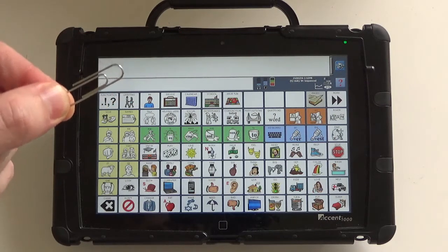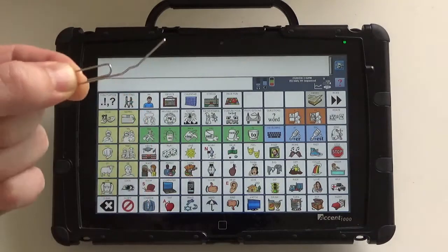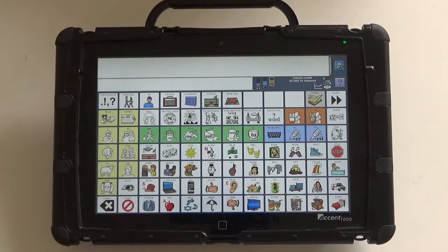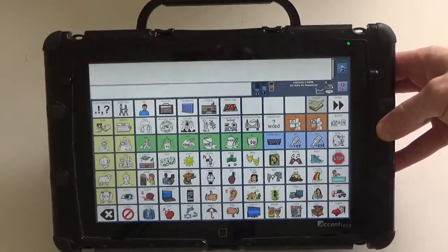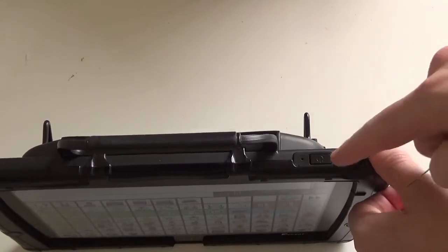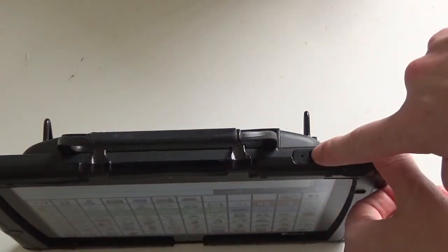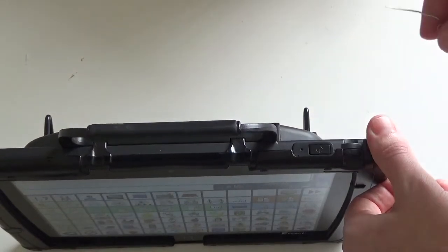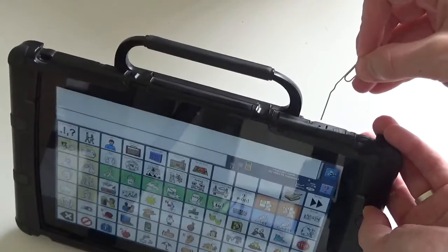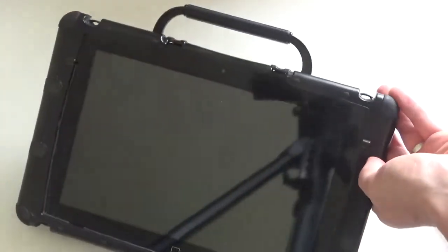First up you'll need something like a paper clip. Open that up so you can get that small little point. We'll turn the device up and you'll see that next to the sleep, standby, or on button there's another small little hole just next to that. So if we have a look at the device — it's on — I'll put our paper clip into that hole and it will turn off.